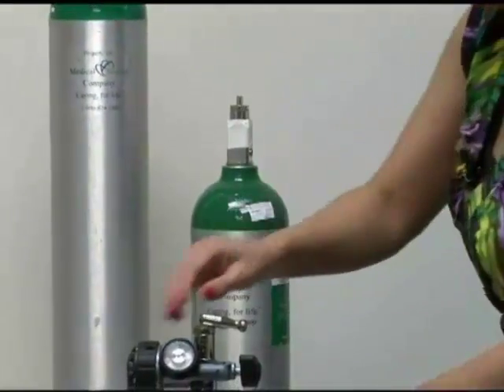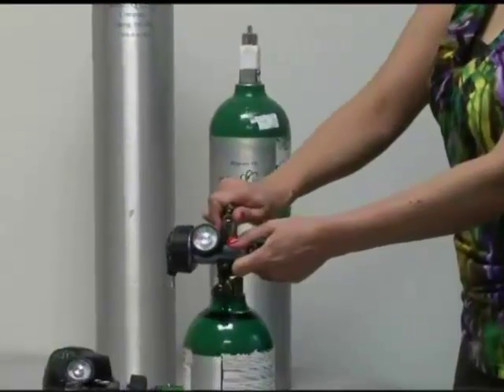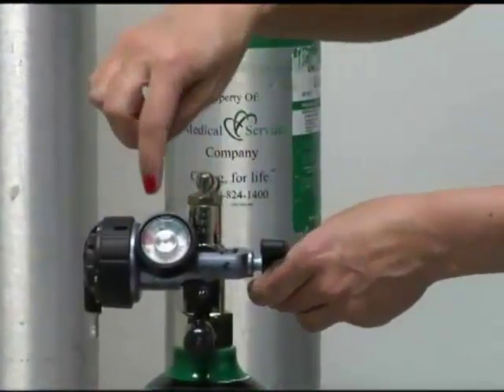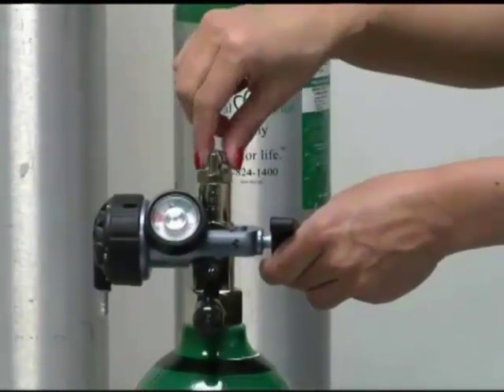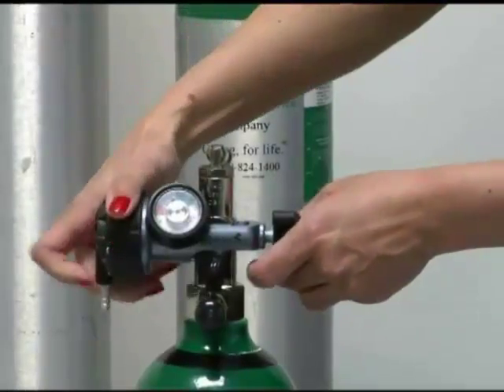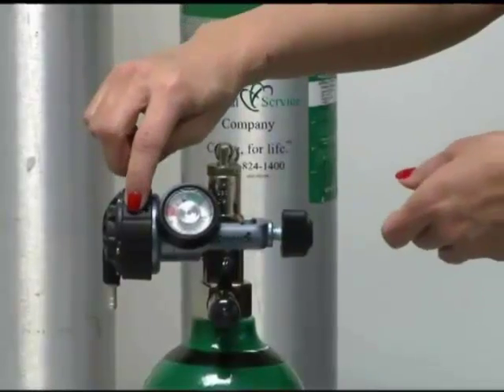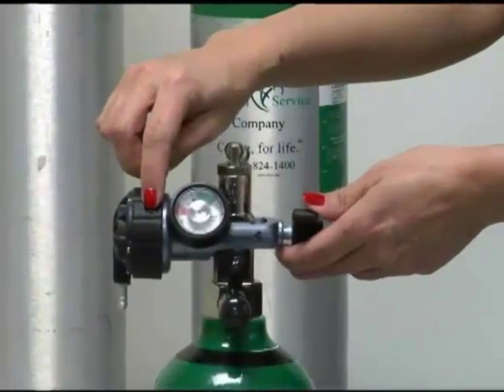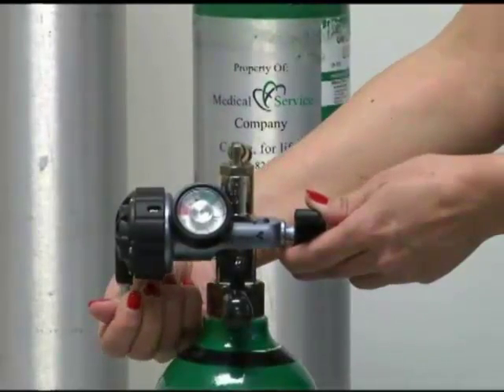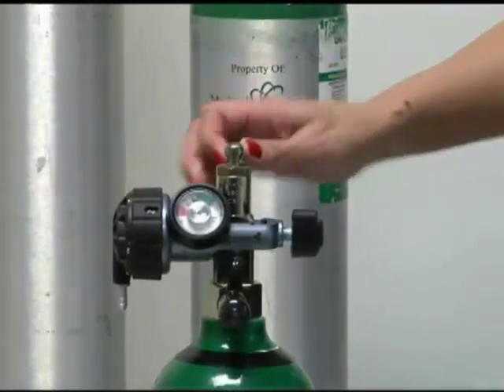Once you've got your gauge on the tank completely, you'll take the toggle and turn it — I usually recommend turning it about halfway. You can see the needle pop up on your gauge so that it's full. Then you can turn the handle on the side and turn it to your liter flow, setting it on the number that your doctor ordered. Then you would connect your oxygen tubing down here and this would be all set and ready to go.